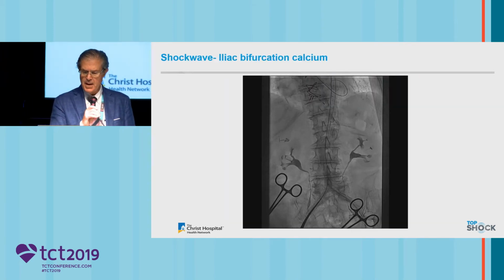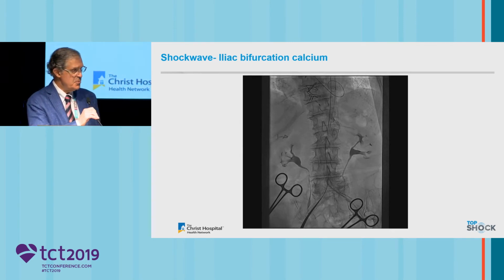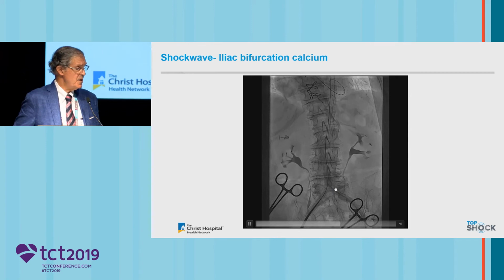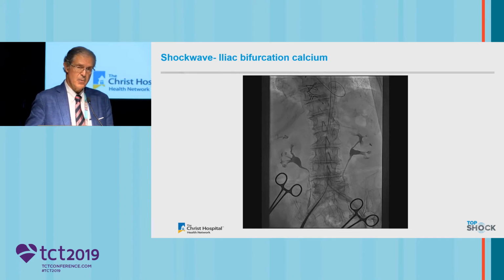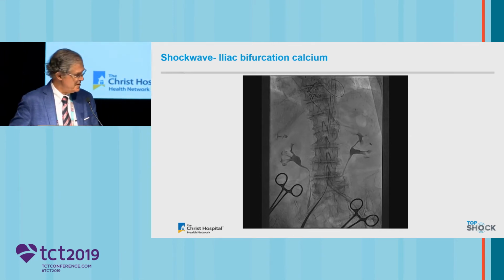And it didn't. This is when I met the lady. I was in an adjacent lab. My partners have a Safari wire in the apex. This is a dilator because they cannot get the 26 millimeter valve across that aortoiliac junction. And so we got looking at this little old lady. They asked me to come over and looking around, and we're saying we're going to cut her down from the axillary. And fortunately, our Shockwave rep, Jesse Halsey, was in the hospital. And he said, let's give Shockwave a shot, or as I say, give it a shock.